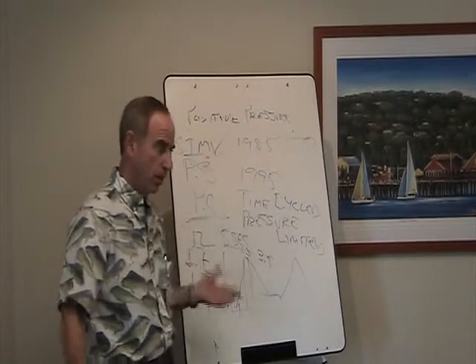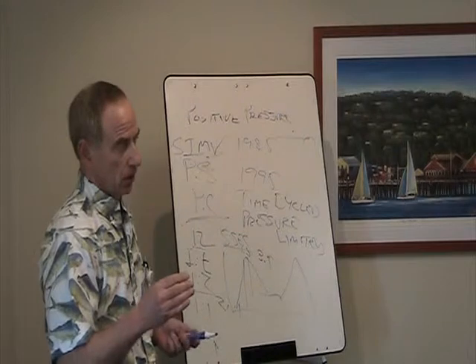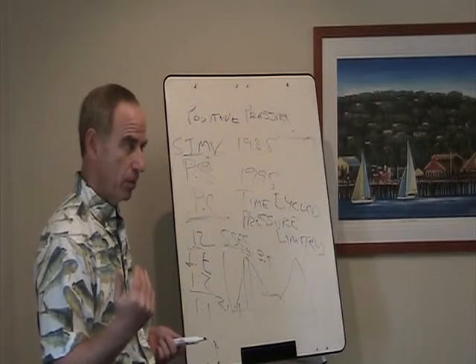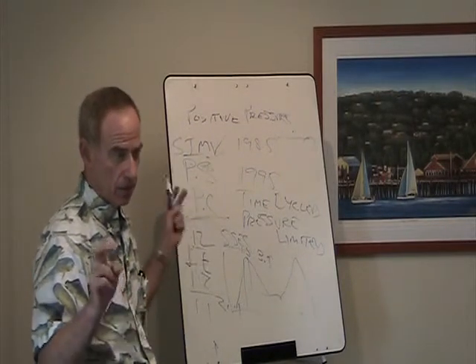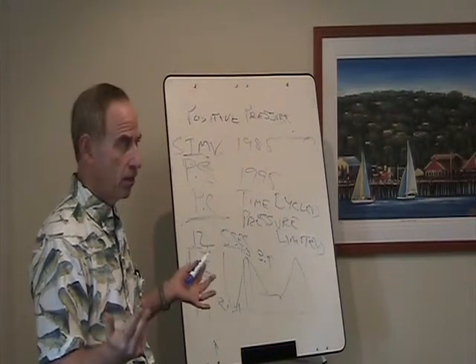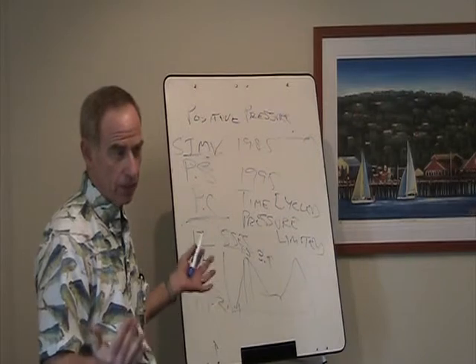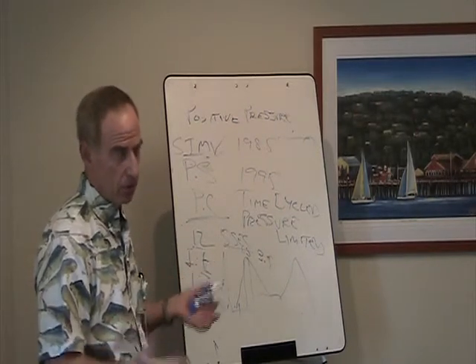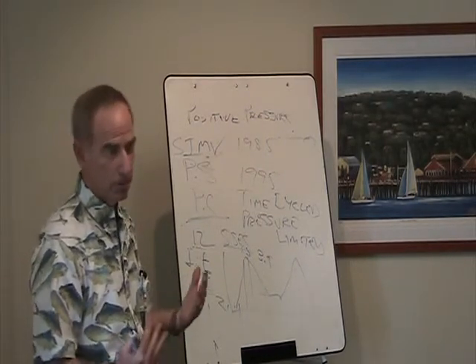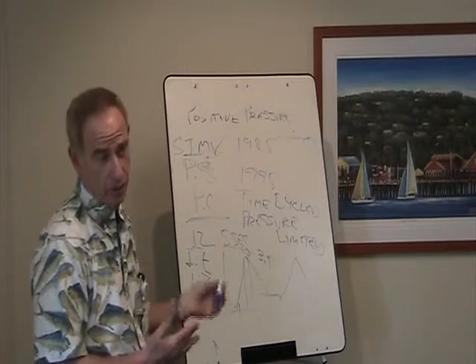Okay, so the thought behind, there's 2 things, okay? First of all, by using a longer inspiratory time and allowing less time for exhalation, what happens? You get air trapping, right? Which basically means you get like an auto peep or an intrinsic peep effect from that, okay? So initially, that wasn't really well understood. In fact, there was a whole mode of ventilation that was called inverse ratio ventilation back in the 80s that was developed, and people were using it a lot initially until they really understood the whole thing it was doing was creating auto peep or intrinsic peep in patients with really severe ARDS. That's basically where it was used and still used.